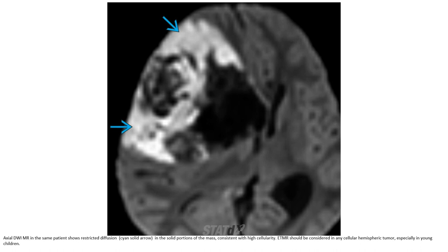Same patient on DWI shows restricted diffusion in the solid portion of the mass, consistent with high cellularity. ETMR should be considered in any cellular hemispheric mass, especially in young children.